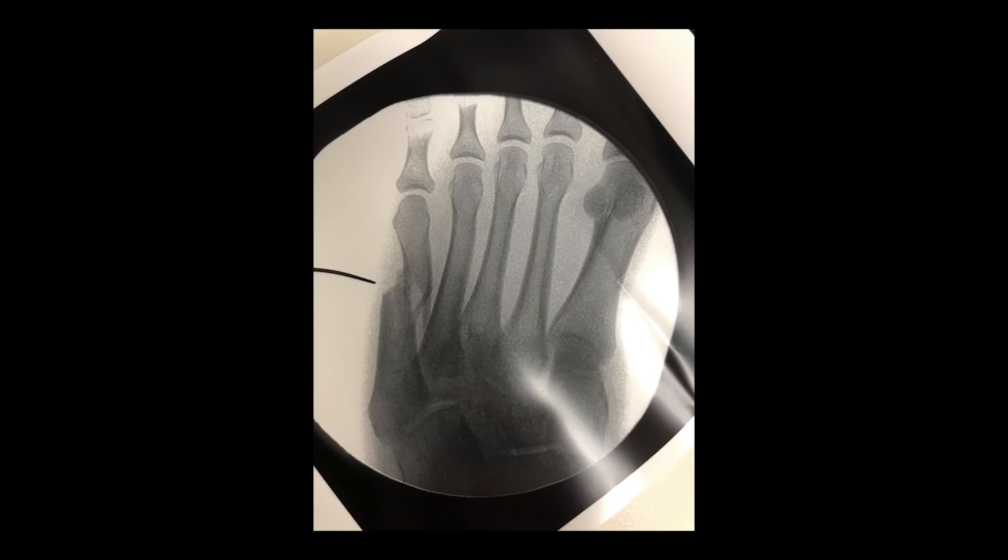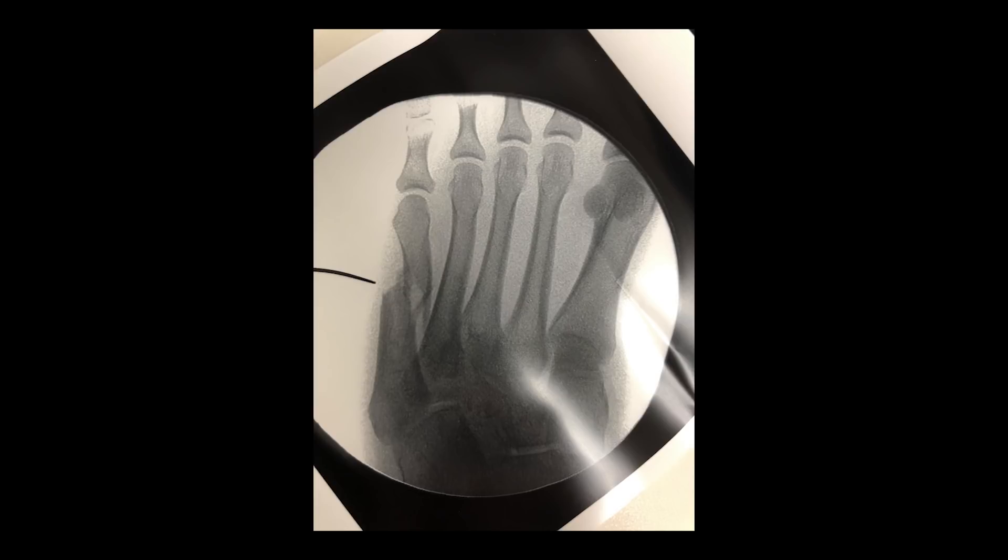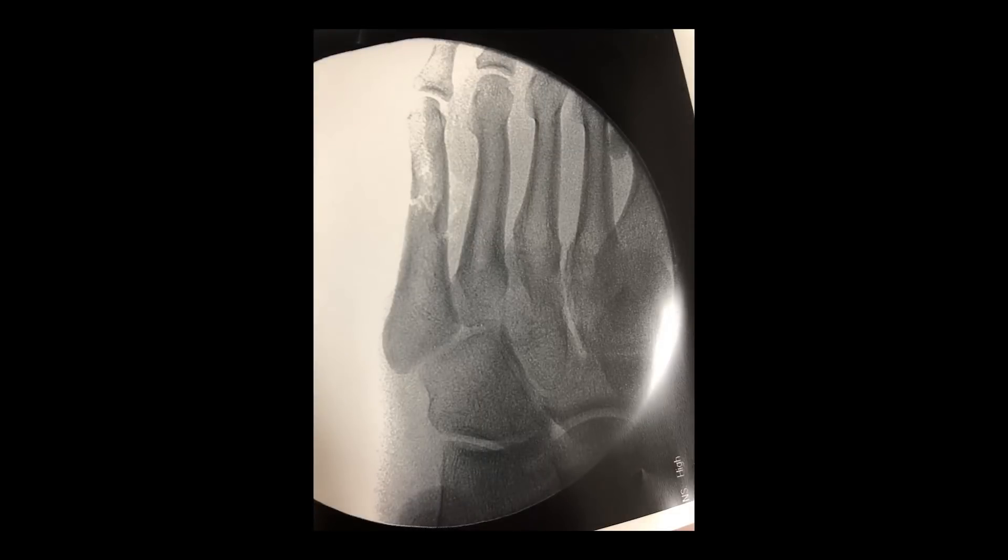Now taking a look at the first intraoperative photo via fluoroscopy, you can start to appreciate even more the amount of comminution involved in this fifth metatarsal fracture. After dissection, fracture exposure, and manual reduction, we've set ourselves up for the fiber wire rolling hitch cerclage technique. You can see the fifth metatarsal is reduced, brought out to length, and is now fixated with three suture cerclages.